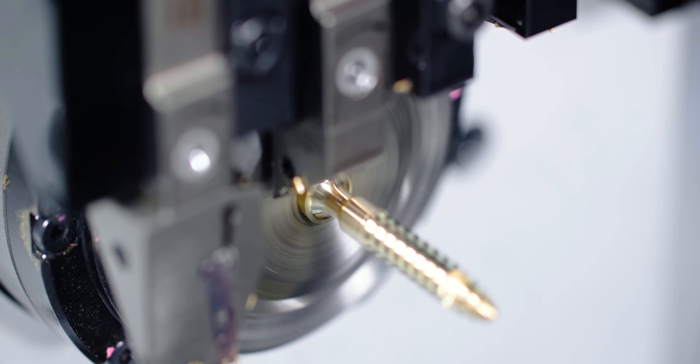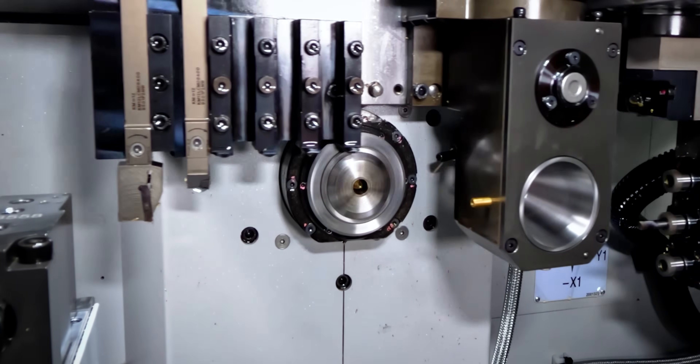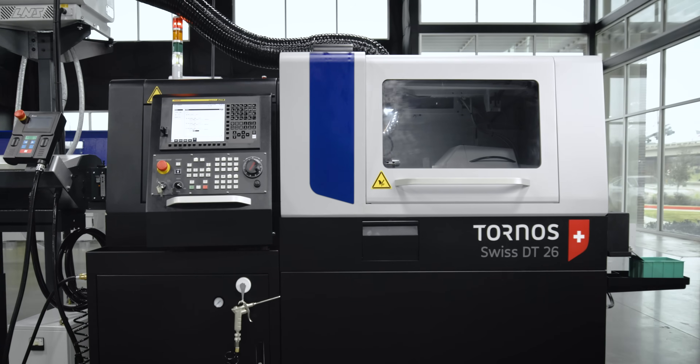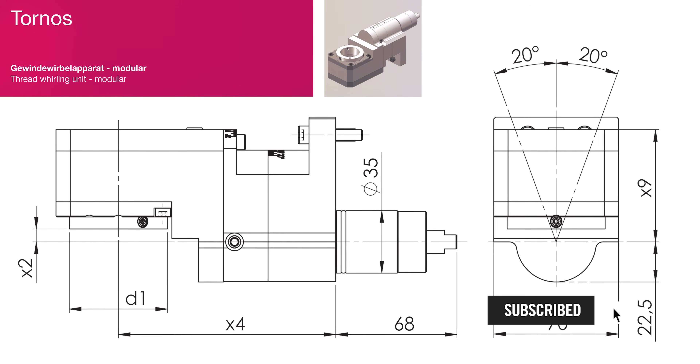If you're trying to get into the medical field, I would strongly recommend the Tornos DT26. I think this is the best bang for your buck to have thread-whirling capabilities and B-axis capabilities in one machine. Not a lot of other machine tool builders actually offer that — usually you have to have a turret and a separate gang with the B-axis to do all this work in one. In the future, we're gonna have a B-axis thread-whirler, so make sure you keep an eye out for that.